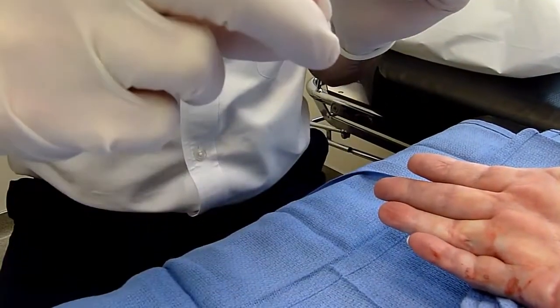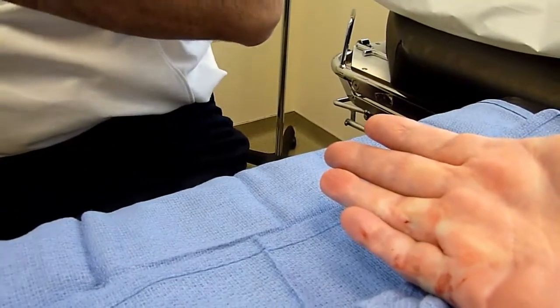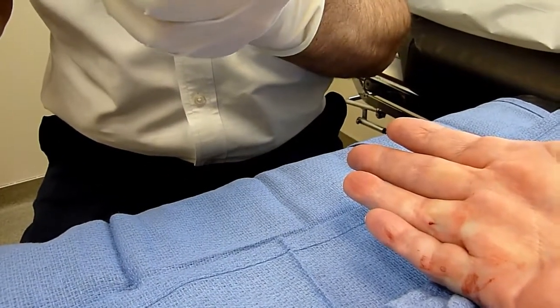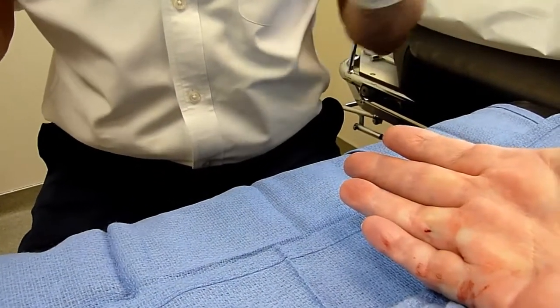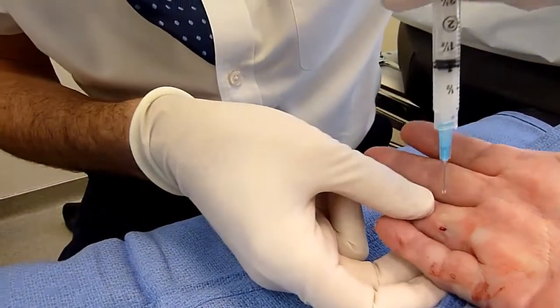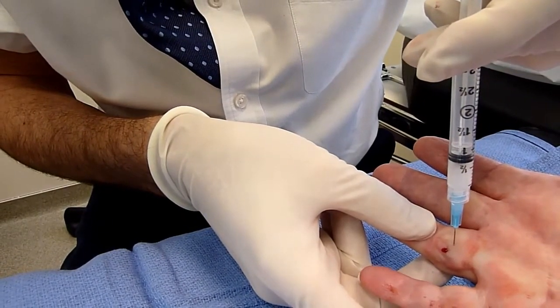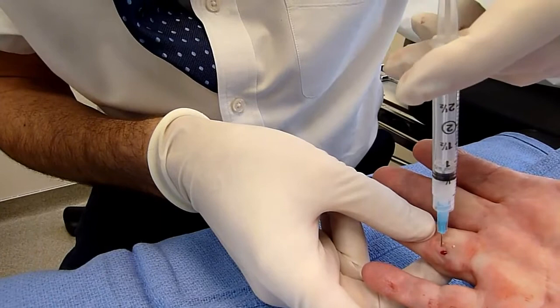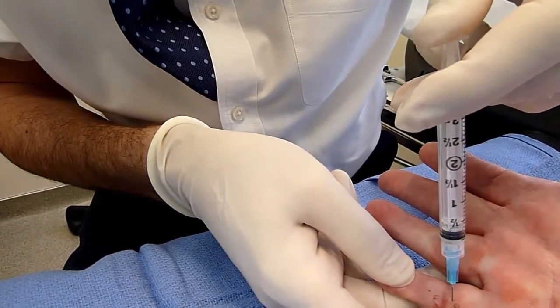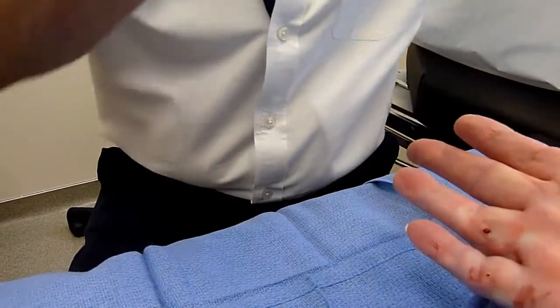The cortisone that we put in, if you know the data on that, they showed that if you put in a bit of cortisone, based upon the appearance of the medicine in the syringe in the French video you showed me, it was all mixed in with the lidocaine and the cortisone. Yeah, okay. They've shown that the recurrence, the fibrous formation, may be delayed with the cortisone. So that is why I followed that advice. Okay. And Charlie did it as well, so I do everything Charlie does. Oh, that just made my hand feel heavy.